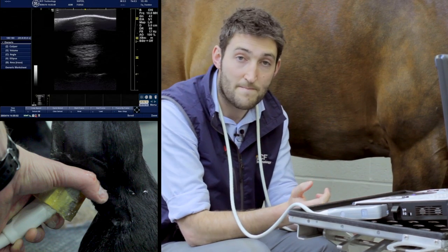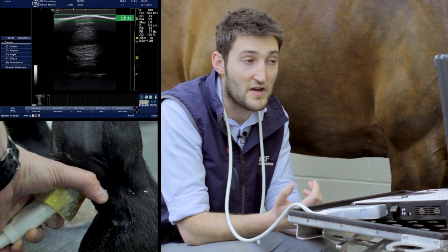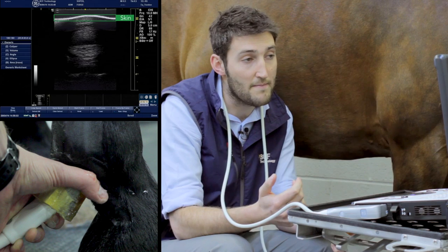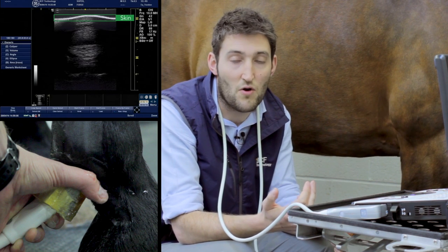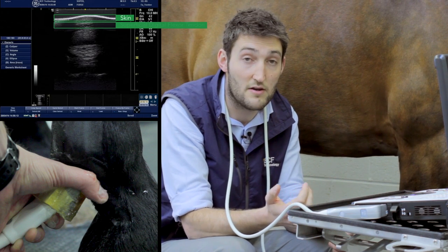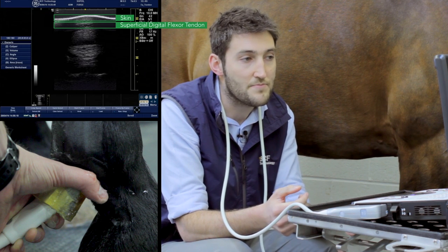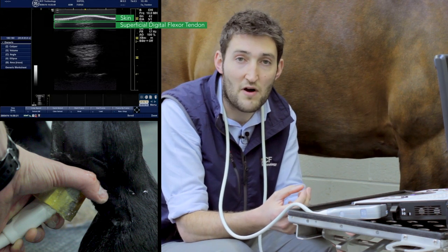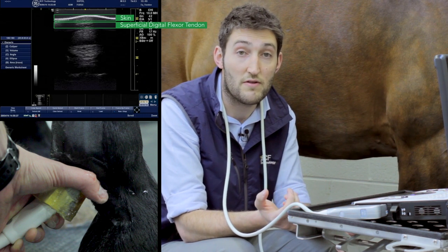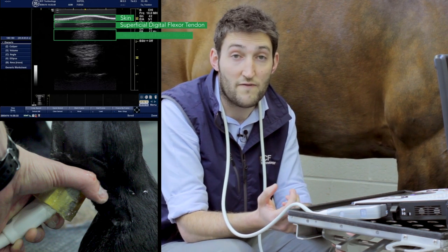Looking at that image, right up at the top we have the skin. Immediately below that is a very thin proximal digital annular ligament, often not discernible ultrasonographically. Then we have the superficial digital flexor tendon, which is quite a thin strap-like structure, slightly crescent-shaped. Below that, we may find there's a little bit of fluid in a distal outpouching of the fetlock joint, and then we can see the slightly ovoid deep digital flexor tendon.